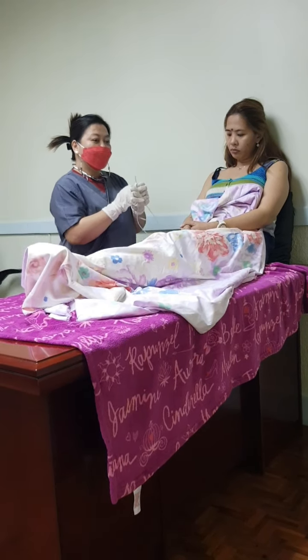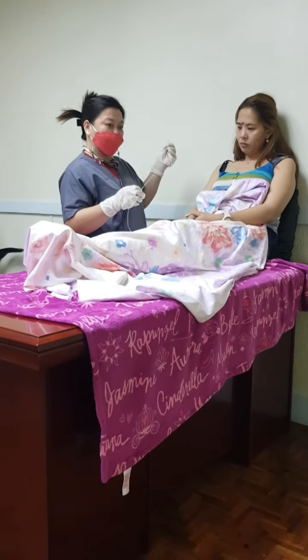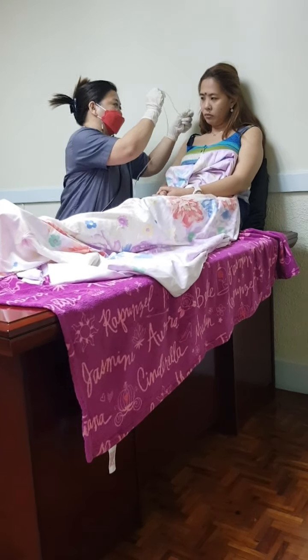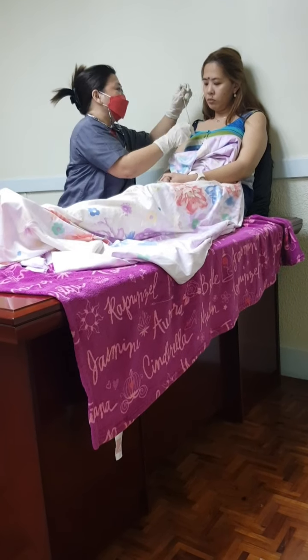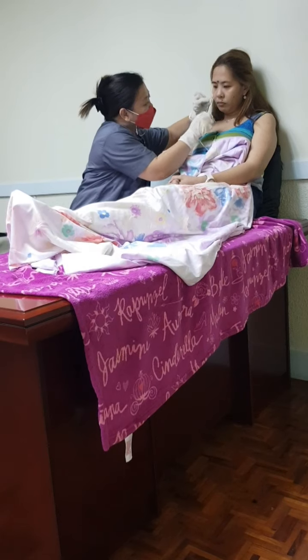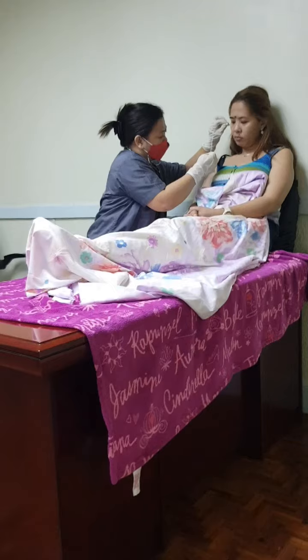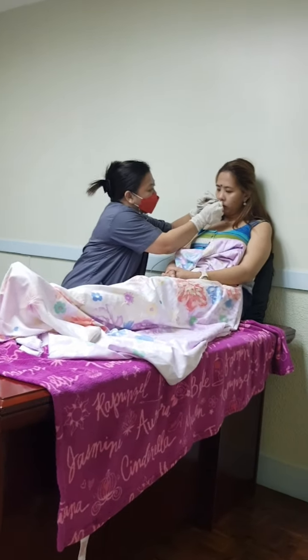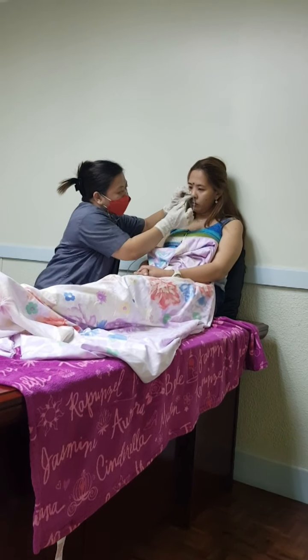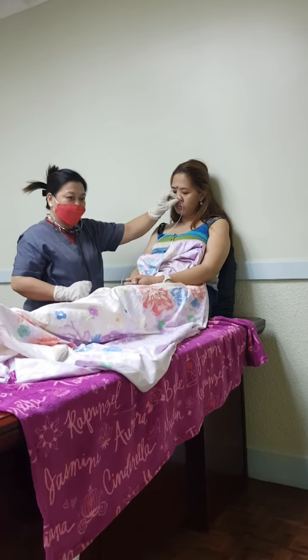Inserting the tube. Insert the tube into the nostril by directing the tube downward and backward, following the normal contour of the nasal passage.